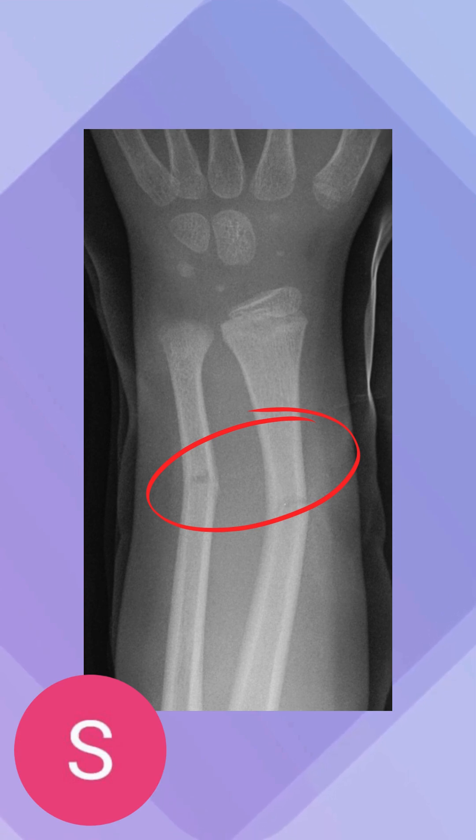Now, this usually happens when there's lots of stress on the bone, so it usually bends or cracks one side, though it doesn't fully break apart, as you can see. It's like a very small indentation, and it's very common to see in children especially, because they have softer bones, whereas adults have more developed, dense bones.